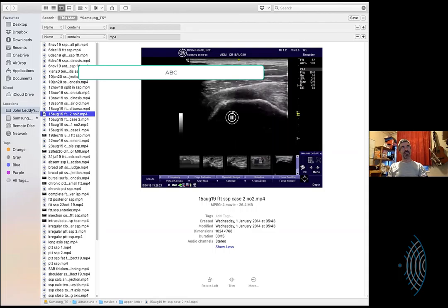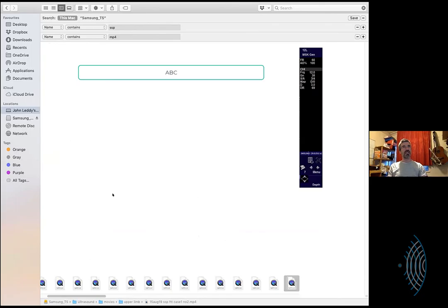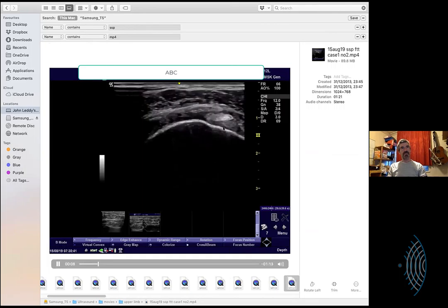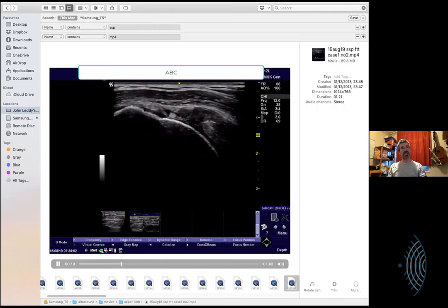No, that's just supraspinatus. Oh, show me one more, then we'll go. Yeah, let's have a look. Let's see what we've got here. What's this one? That's the one we just talked about. That's the same one. This must have been a busy day with supraspinatus, full thickness tear. Let's switch over. This is probably more of the same. This is just another big supraspinatus tear.